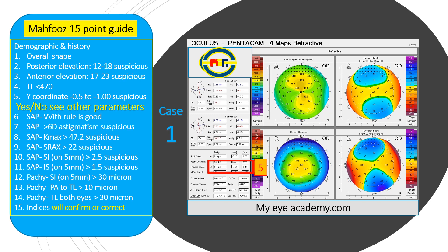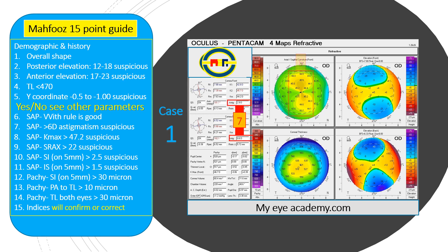Now we make our mind — all five parameters are within the normal range, so perhaps it's a normal corneal topographic map. Let's confirm it with the rest of the parameters. The bow tie is vertical — V for vertical — and if you join two V's together that makes 'with the rule,' and with-the-rule is good. So it's not suspicious — another good sign.